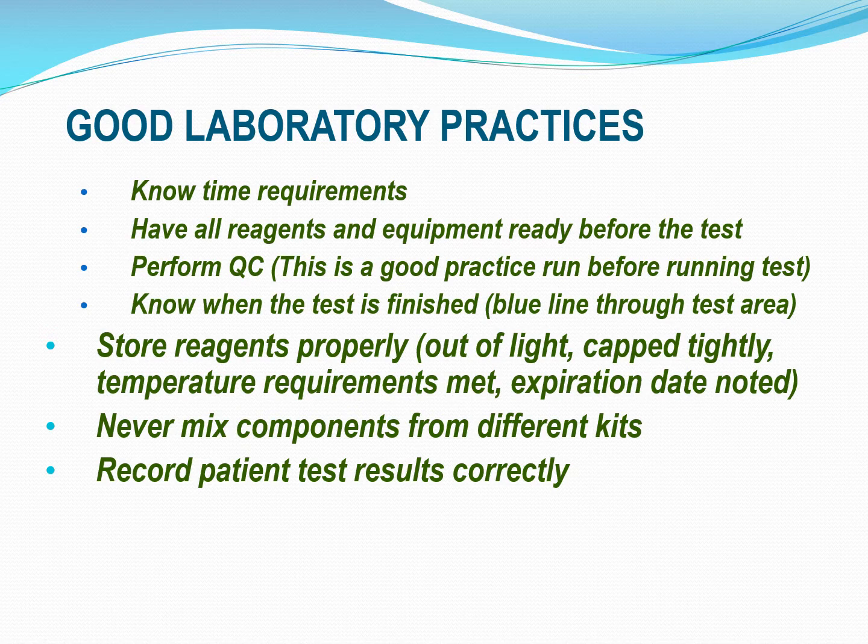Then going forward, when you have a patient come in and the doctor orders a pregnancy test on them, you properly ID your patient, properly collect your urine, and properly run the test by the directions. You look to make sure that QC's already been run on that kit. If it has, you just run that patient. As long as that internal control comes out properly, then you can print out your results. You can record your results as positive or negative.